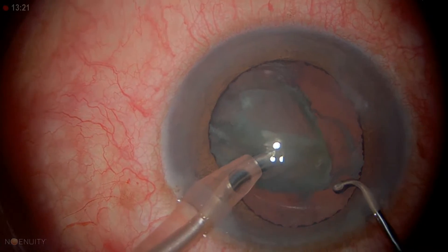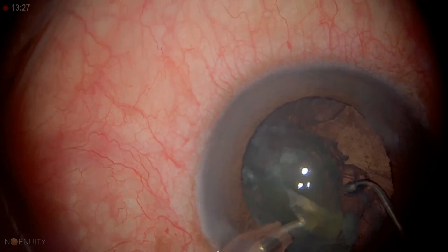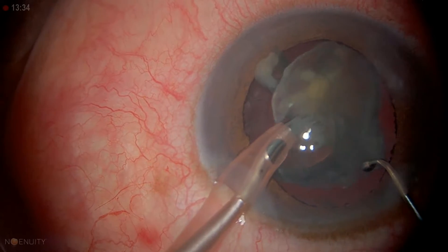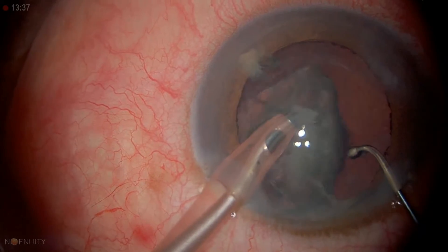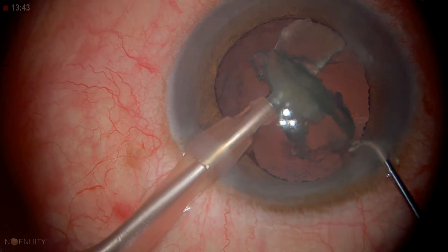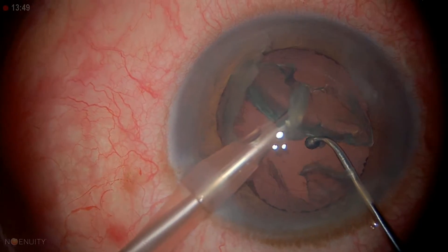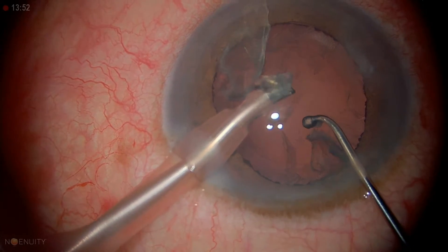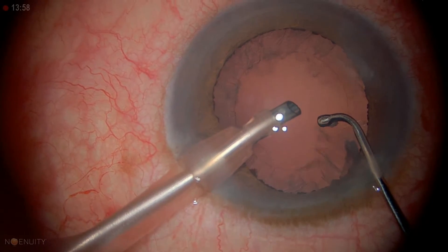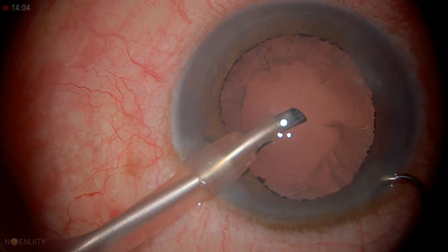Last piece — it's a little big. You can hold it, bring the chopper around, and separate it, though sometimes that's not so easy. I'm keeping this in the center — I'm not really moving my tip around, just rotating a little bit. I'm keeping my second instrument close by, below my phaco tip. We just rotate, using our fluidics. There's a little cortex here — and it actually came out. We're all done.